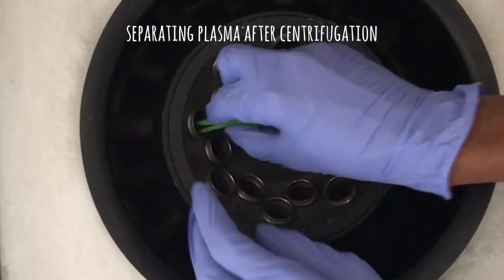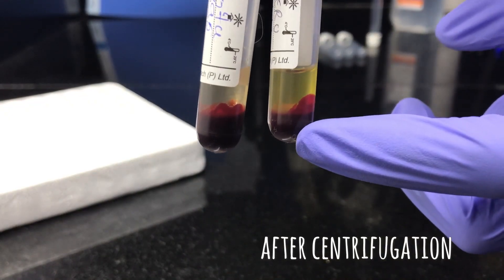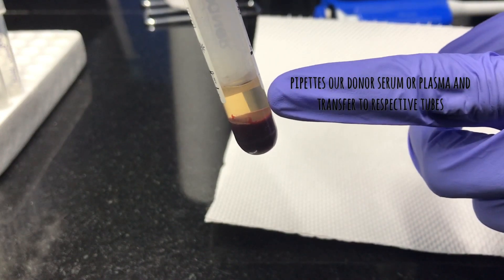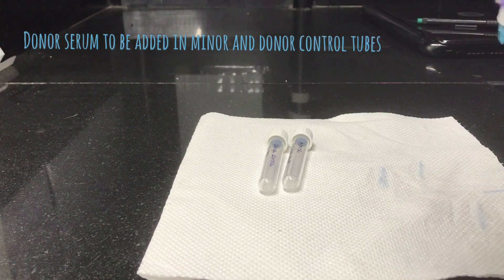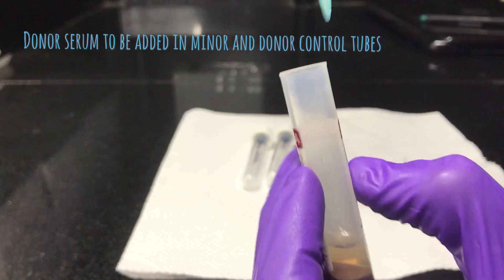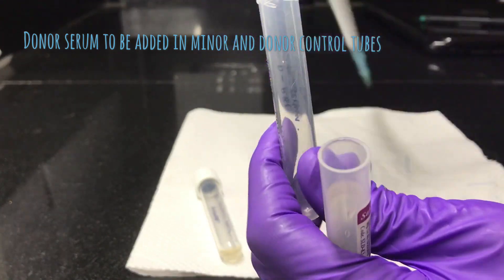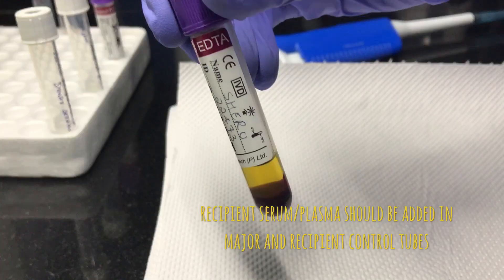Start separating plasma after centrifugation. Plasma can be separated and transferred into plain test tubes. The packed cells at the bottom will be taken for erythrocyte washing. Start separating the serum from the donor sample and transfer it to tubes named minor and donor control, because both minor and donor control require donor serum or plasma. Similarly, start transferring recipient serum into major and recipient control tubes.